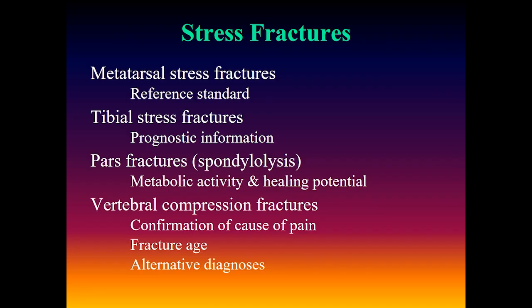Bone scintigraphy is also used in the evaluation of various types of stress fractures. For metatarsal stress fractures, it's often been the reference standard for diagnosis. For tibial stress fractures and for pars fractures, such as in spondylolysis, it offers prognostic information.